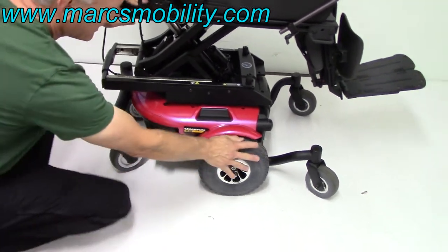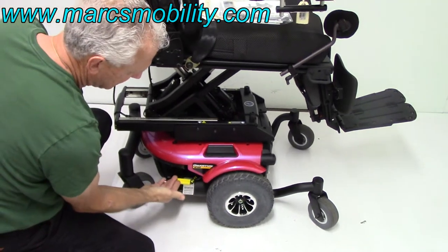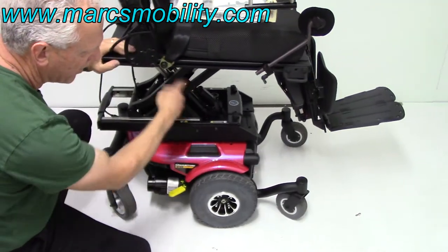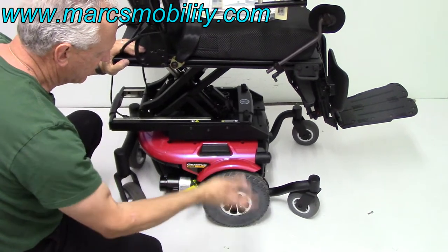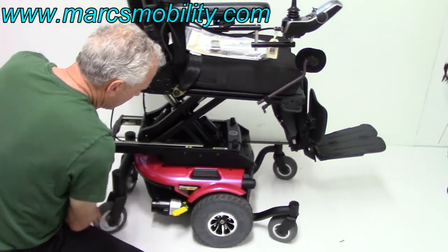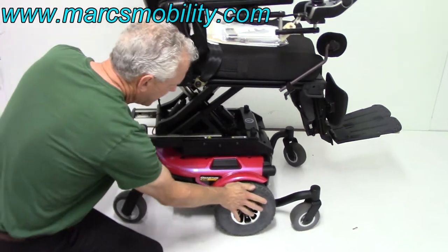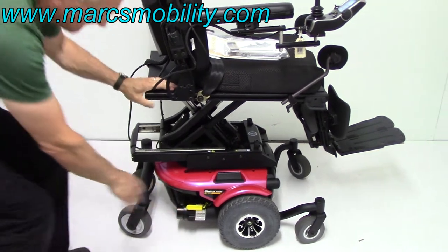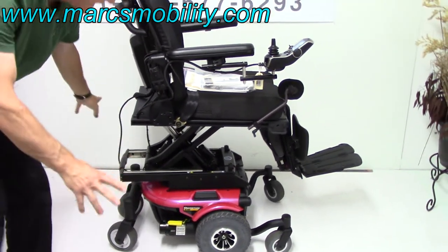If I wanted to put this chair in neutral right now, you can't push it as-is. Take the handle, pull it out, and now the wheel is in neutral. You have both sides, and you can push the chair around. This chair weighs about 275 pounds. Put it back in gear and your wheel is locked. That is your electric neutral handle on each side, on each motor.